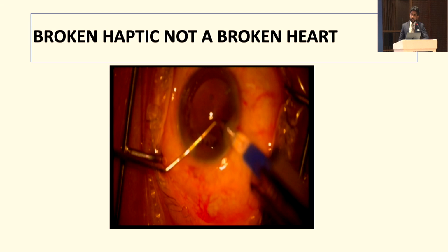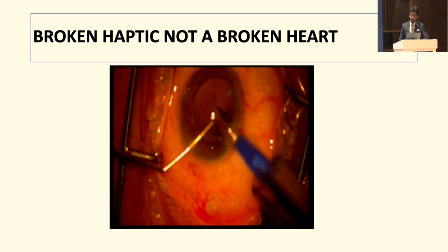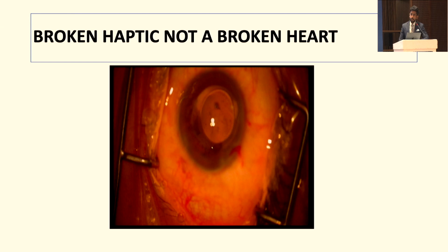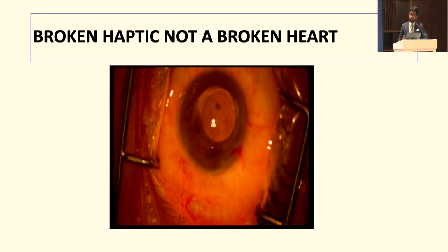and when you're inserting the other IOL as a scaffold, you can cut the first primary IOL which you had implanted using an IOL cutting scissors. Oftentimes, when you cut, the IOL slips forward. So use a secondary instrument such as a phaco ball tip dialer or any Y hook, so that you can grip the IOL and cut it, and after which you can remove it through a 4 millimeter or a 4.5 millimeter incision.